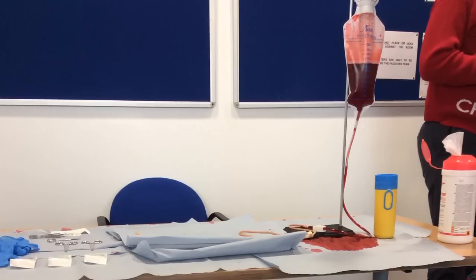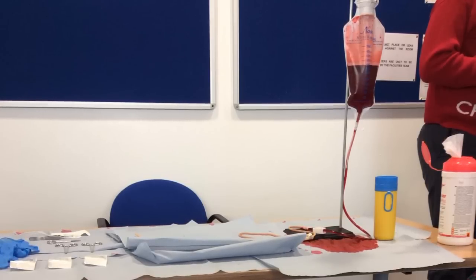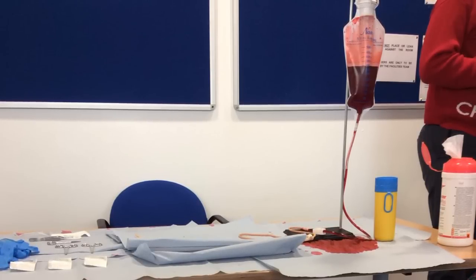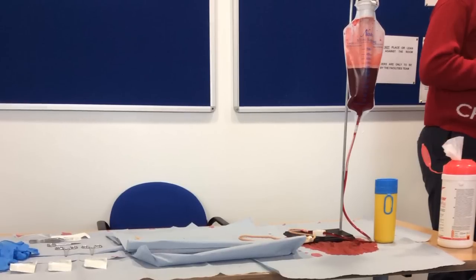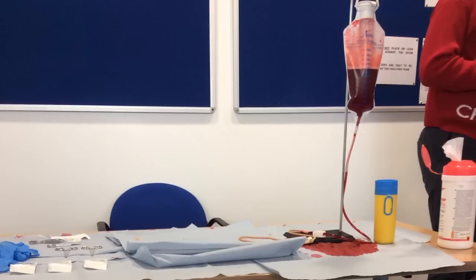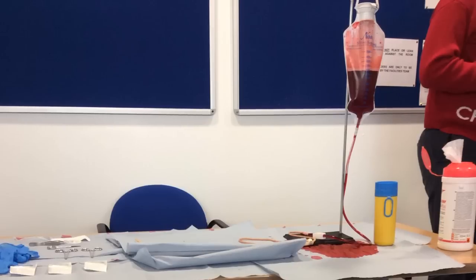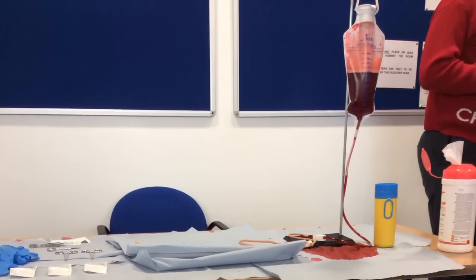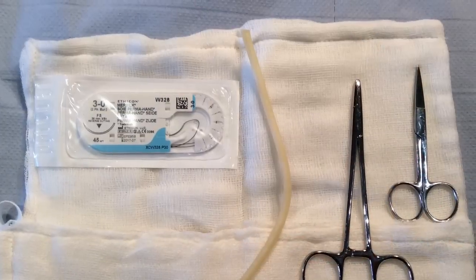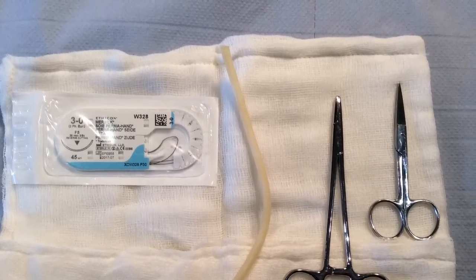In order to perform this skill you will need to set up the following: an IV bag with fake blood as shown in the photo. You will need to attach an artificial blood vessel to the IV line with an IV line stopper to control blood flow. All of this equipment is readily available in the Clinical Skills Resource Centre. You will also need some suturing material and a hemostat.